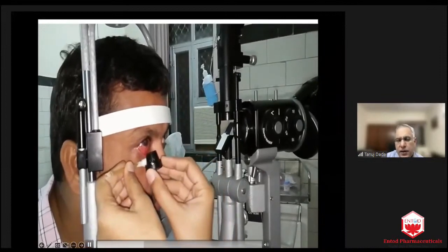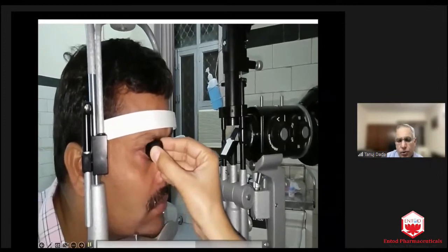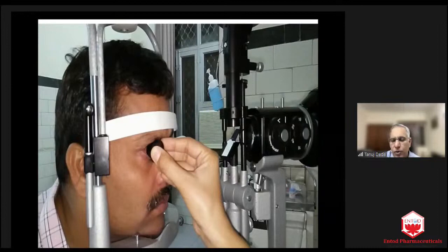You just hold a swab stick, you retract the lower lid, and put the gonioscope in the eye. You have to first explain the technique to the patient, because some patients are very apprehensive that you are going to put a lens in the eye, that you have to apply some pressure. And secondly, you have to apply topical anesthesia, and always ask the patient, has he come alone driving? If the patient has come driving, then don't do gonioscopy in both eyes at the same time, because he will have difficulty when he goes back. So ideally, he should come by public transport or somebody should accompany him.